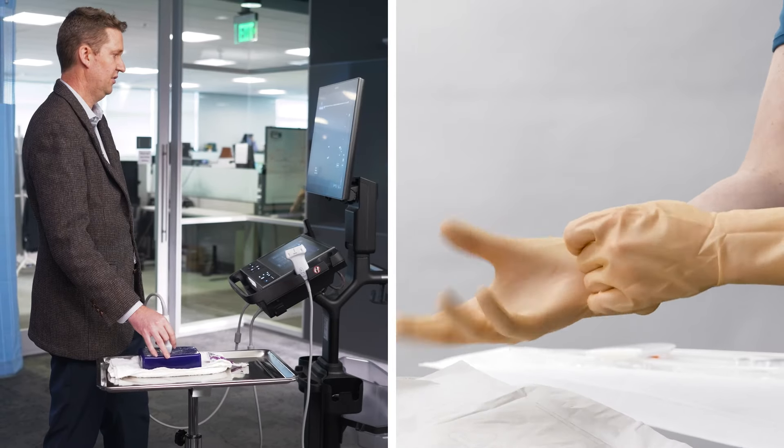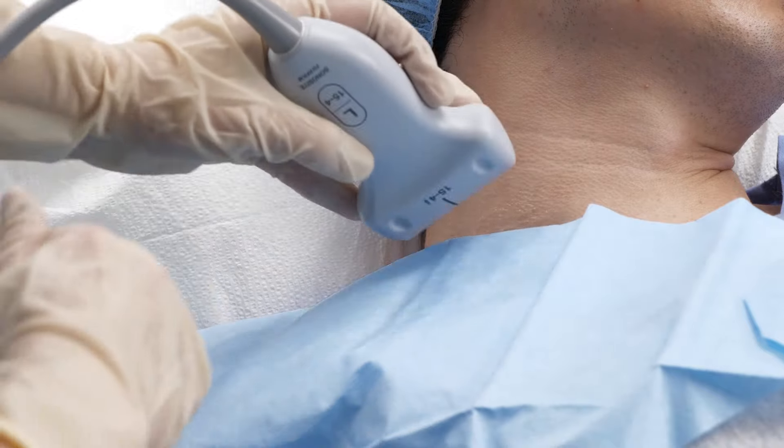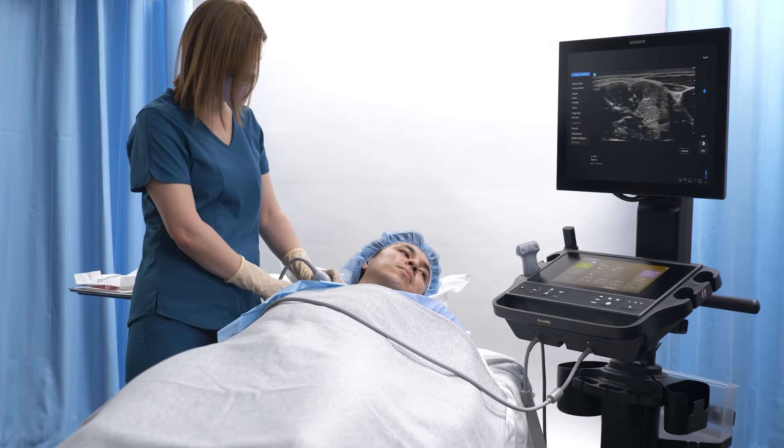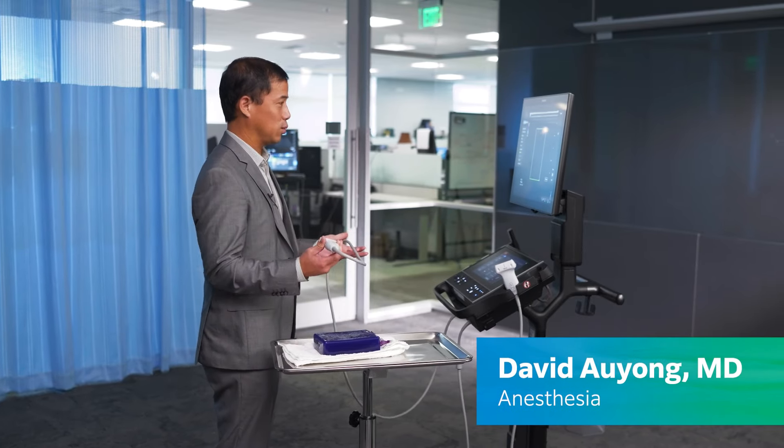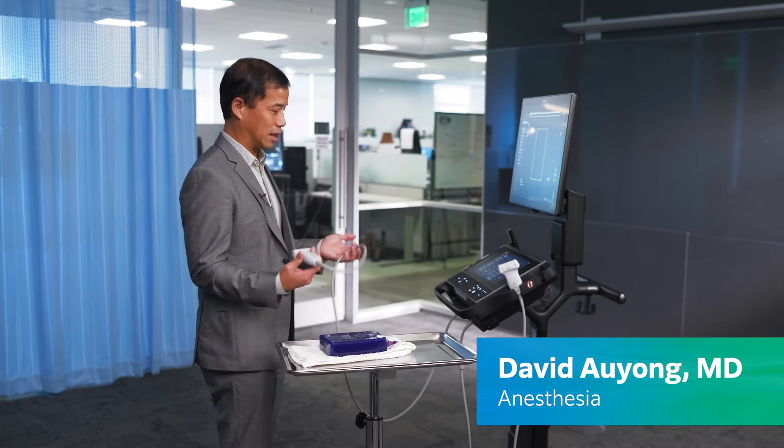You can imagine this enabling a more hands-free, sterile environment. All the time I've got sterile gloves on both hands, so I have no ability to do this without an assistant there. It actually frees up a lot of things.